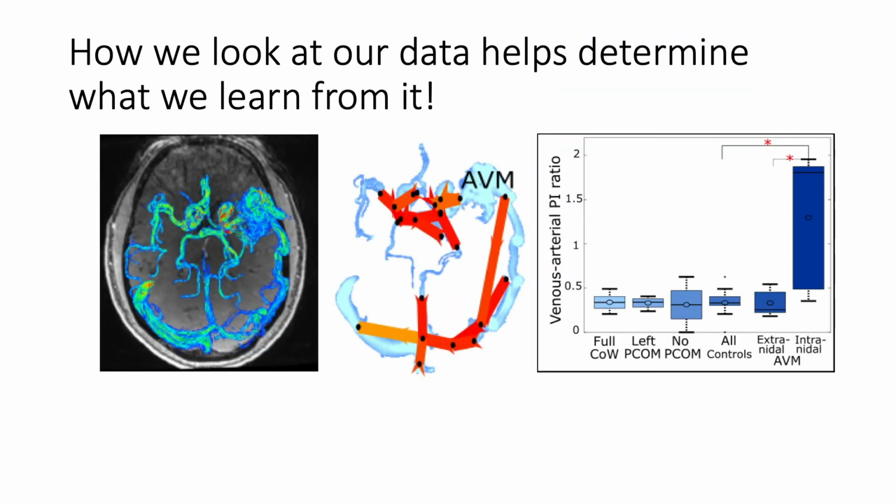So that work is still in progress, but what I hope to leave you with today is that the way you look at your data can really impact what you can learn from it. And I hope you find that as exciting as I do.